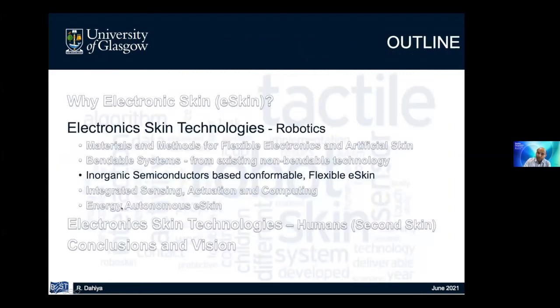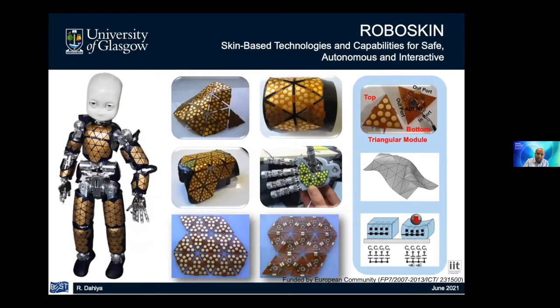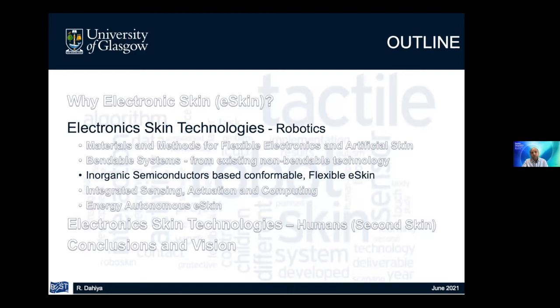That was one example. But the bottleneck in this example is that, while you are able to use off-the-shelf components, because of the rigid components being used, the bendability is not high. If you go back to this image, you can see the skin is mostly on areas of body parts with large curvature. Whereas in medical applications, you have surgical instruments such as those for minimally invasive surgery, where you enter the tool through a small hole and the curvature is really small, and you need new solutions. You need to develop new solutions to get the tactile image from inside the body, or to allow clinicians to palpate the tissues inside the body. To that extent, one has to look into new electronics, new solutions.